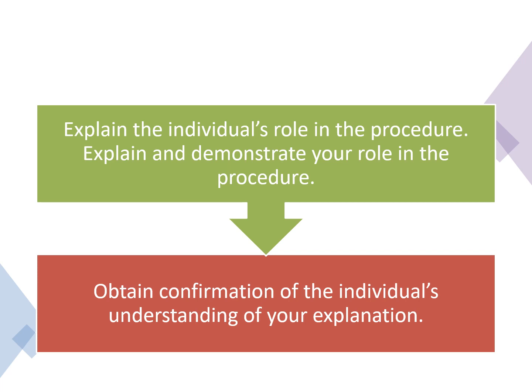So then you obtain confirmation of the individual's understanding of your explanation. Then you need to find out whether the patient understood the entire procedure or not. If you are thoroughly sure that the patient has understood the entire procedure, whatever you have explained, and if he has any clarifications, please clear that also, so that in between when you are doing the procedure, the patient is not hesitant, the patient is cooperating well, so that your readings are good.